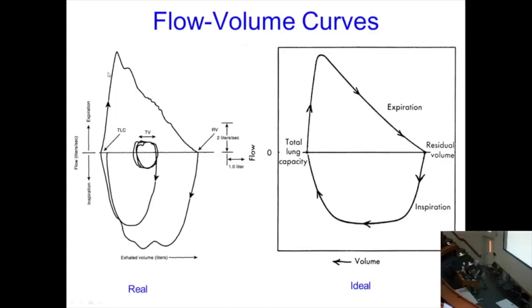Okay, and then you have them breathe in and totally fill their lungs as fast as they can. Okay, go. Okay, so that's the whole loop, and it has this kind of characteristic shape, and the expiratory flow looks different than the inspiratory flow.